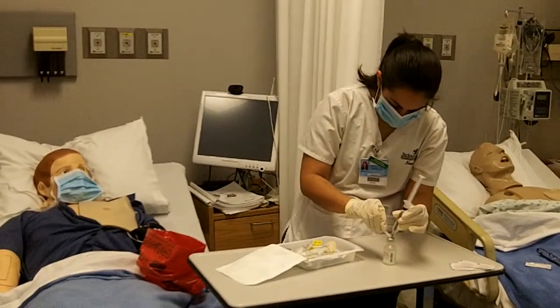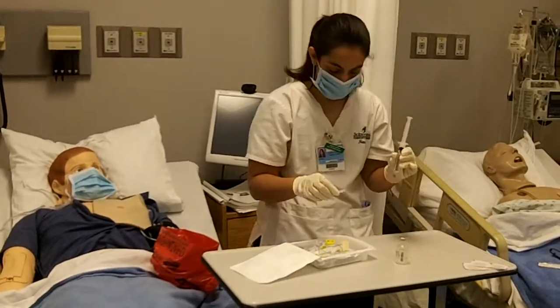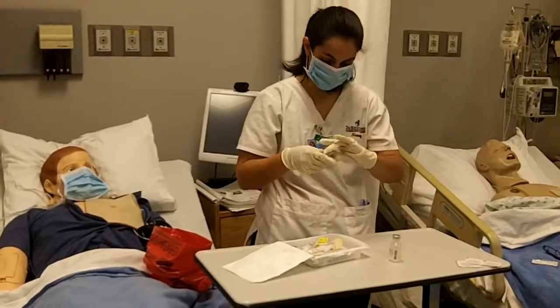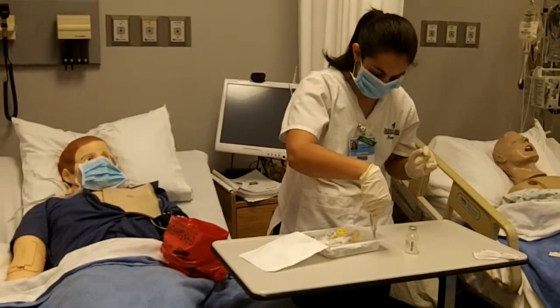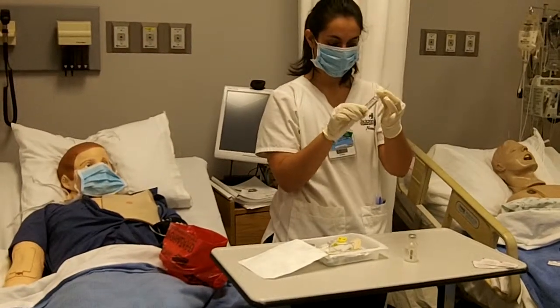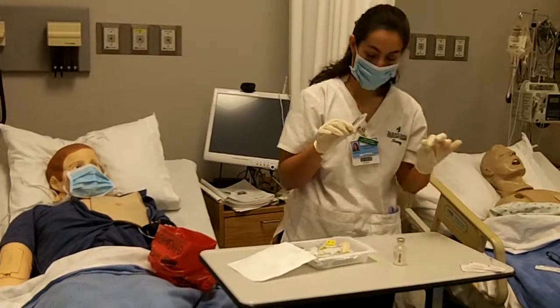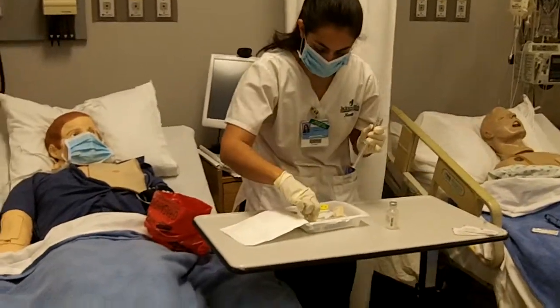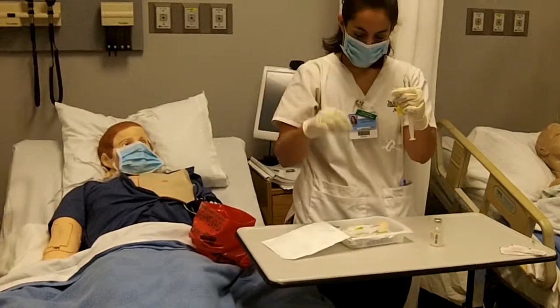On the cap, I only touch the rubber part. And I recap my needle. And I put it in my sharps box. Now, I uncap my Huber needle.